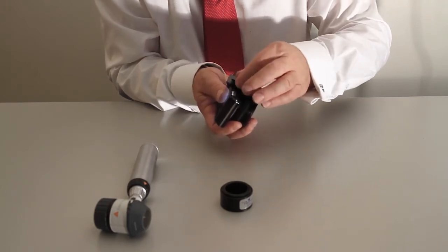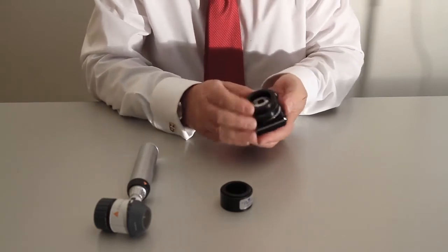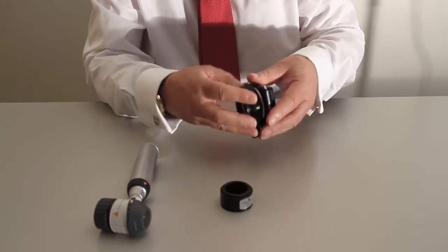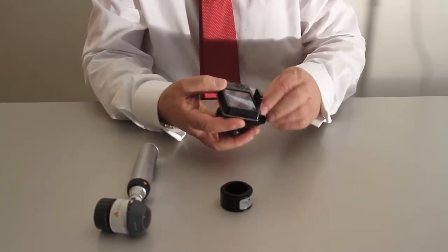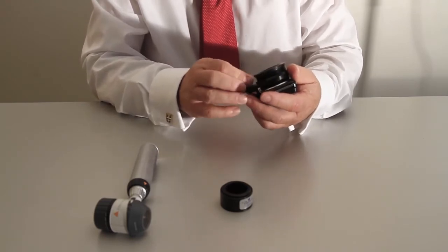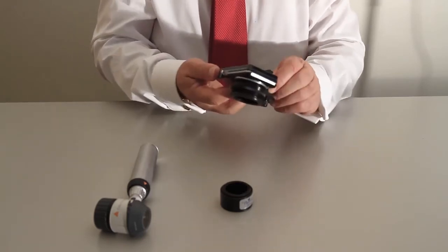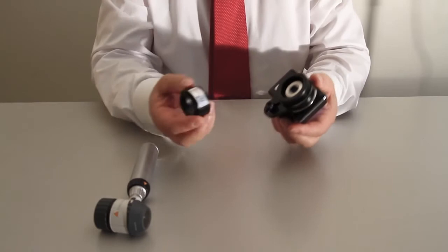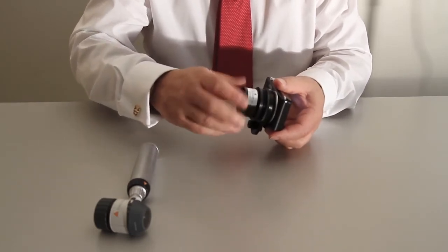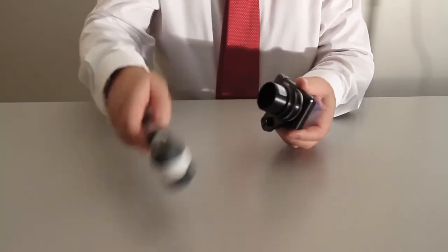If you turn the camera over, you can just make sure that the aperture of the bracket is nicely centered on the lens. You can adjust it in both planes, forward and back, so that it's in just the right position there, tightly up against the camera and in the middle. Make sure all your screws are nice and tight, and then you take the little cup that has come with this bracket and that just neatly screws onto the front like this. Again, make sure that's done up nice and tight and that you don't dislodge the position.